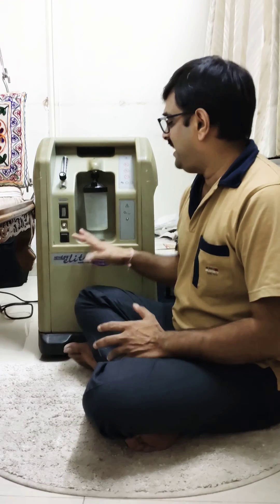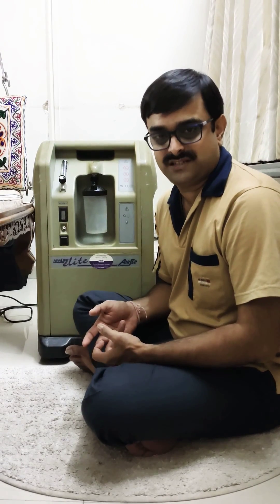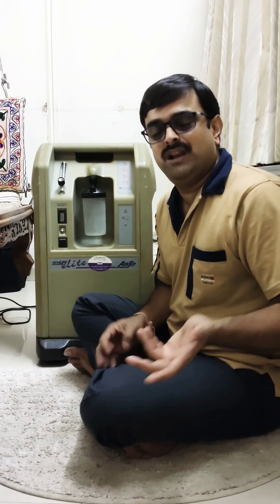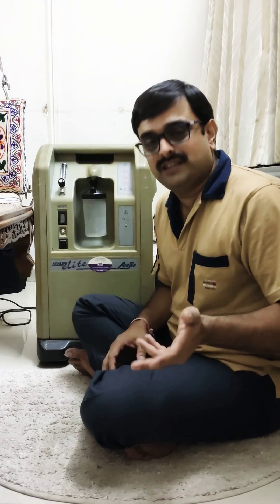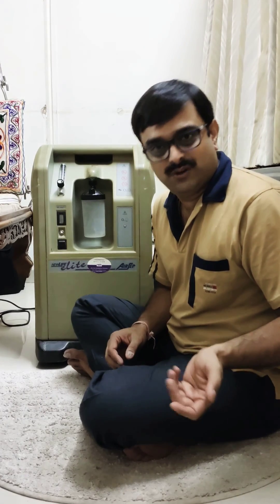I have tried to explain a few issues with the machine. Furthermore, I will be uploading one more video with many other troubleshooting problems. Thank you.